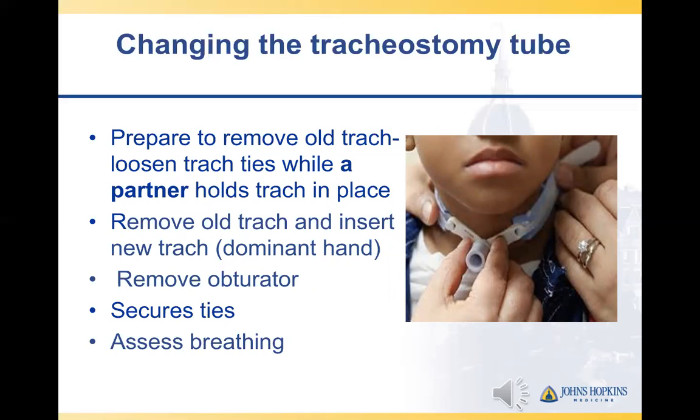It is recommended that you use your dominant hand to do this. Quickly remove the obturator once you have the new tracheostomy tube in place and secure the ties. You should then assess your child's breathing.